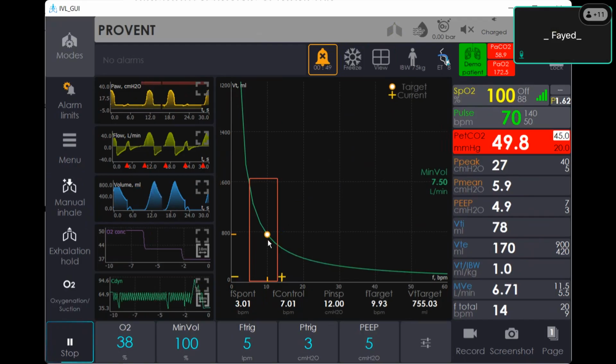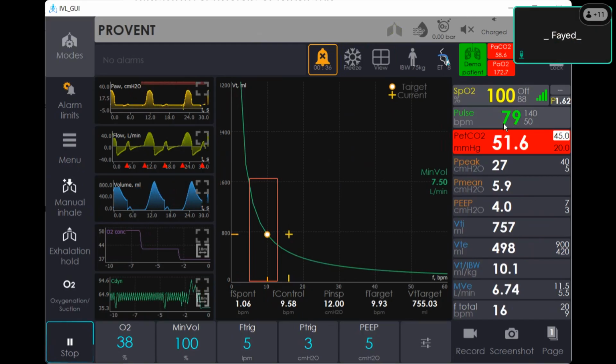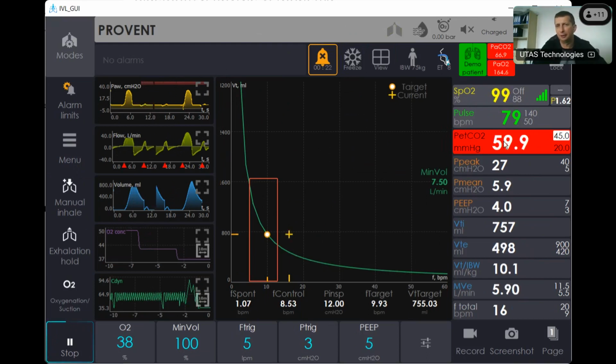For the icons like O2, the percentage down in the screen, can we control this? Like, can we get the icons from the right and put them down? Like SpO2, can we make it go down? No, the SpO2 and CO2 are always at the top, because these are the most important parameters related to ventilation status and gas exchange status. But all the other parameters we can customize.